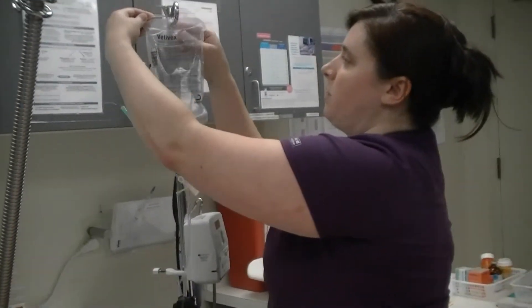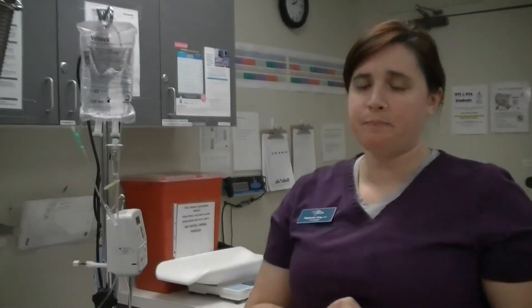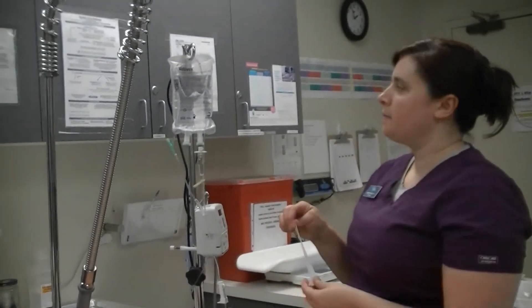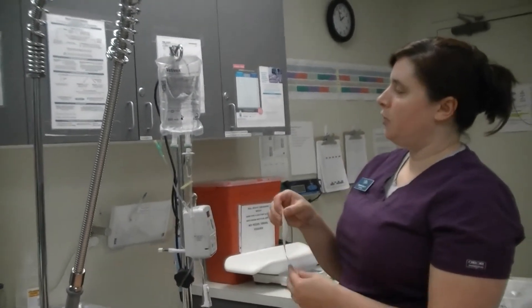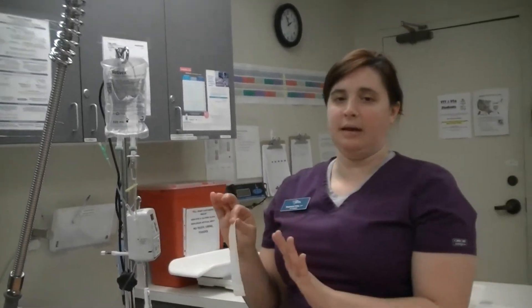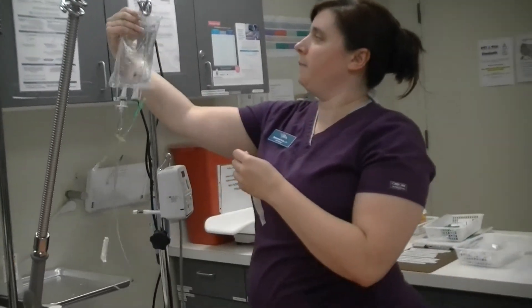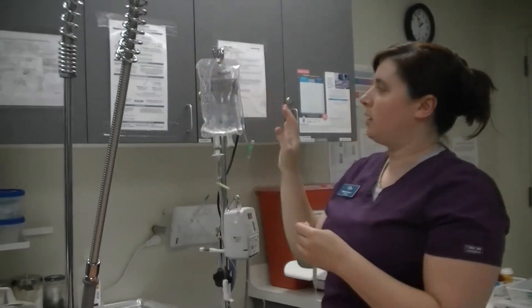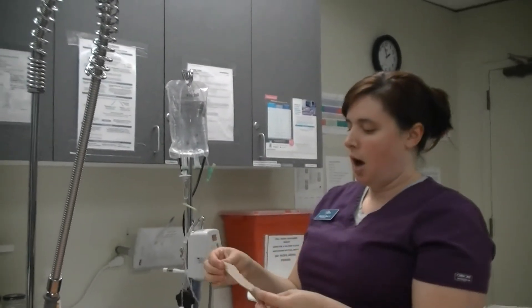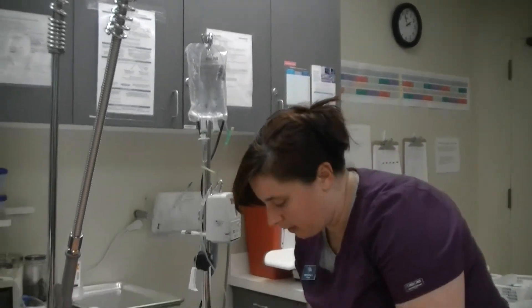Just as with any drug or anything we administer to a patient, fluids are the same — we want to make sure they're labeled appropriately. I've got a piece of tape here. The most important thing is that there is a piece of tape with the animal's name and the date on the bag, so we know when it was punctured and who it was punctured for. I'm using tape and not writing directly on the bag with a Sharpie, because the Sharpie can actually bleed into the fluids.